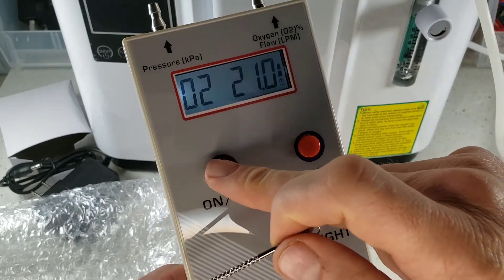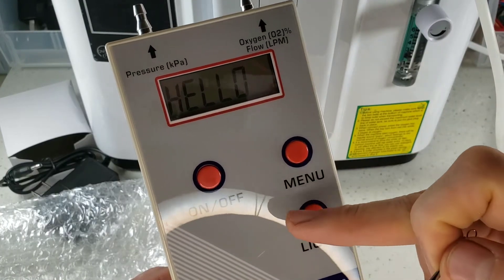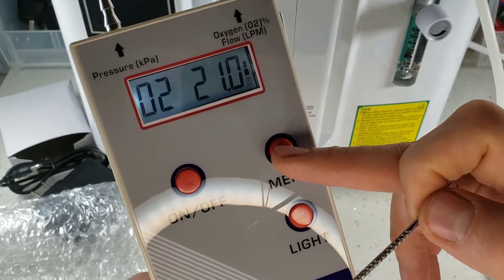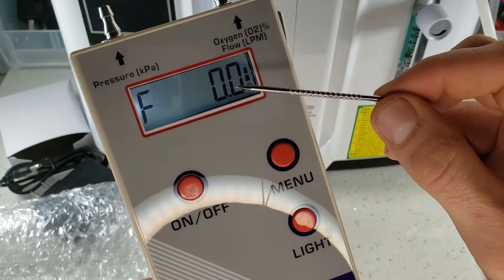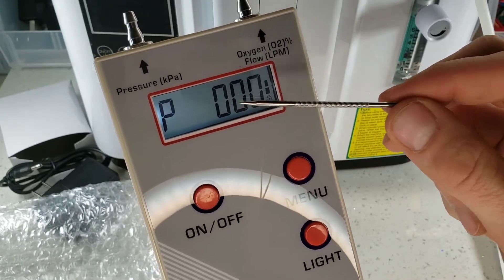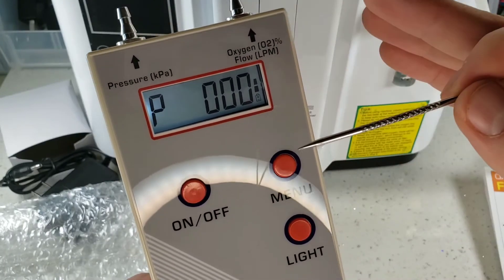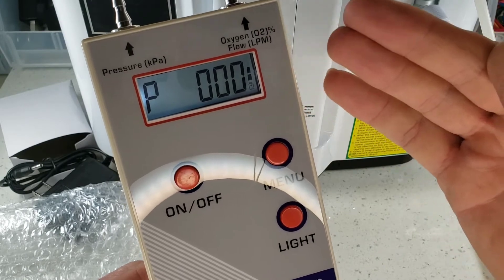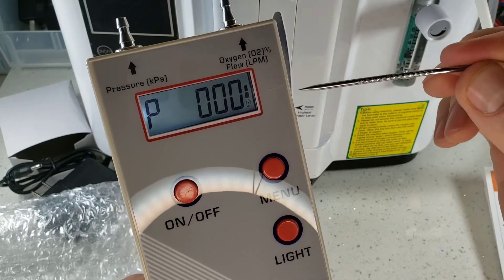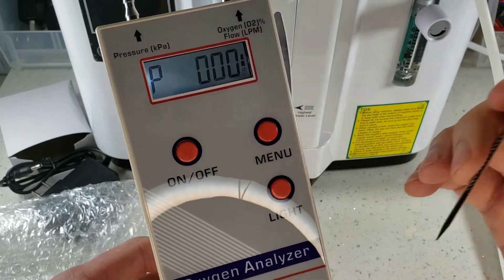We have our large on/off button — press that off and it turns off immediately; press it on and it comes back on. For the backlight, just pop that on. The menu lets you determine if you want to detect oxygen, flow in liters per minute, or pressure in kilopascals — that's an important parameter. These are all digital sensors included within the analyzer. Not all analyzers have all three features at once — that's what makes this analyzer very special. The oxygen sensor in here is an ultrasonic sensor: it does not need calibrating and can last well over five years.